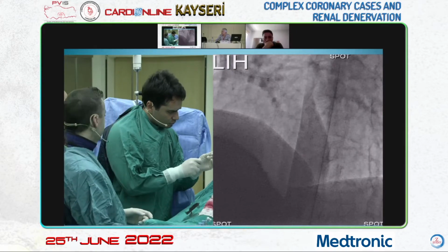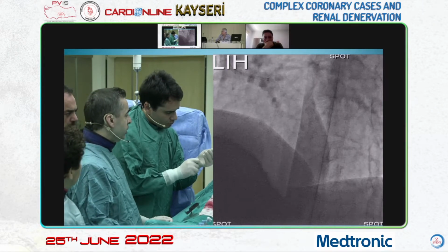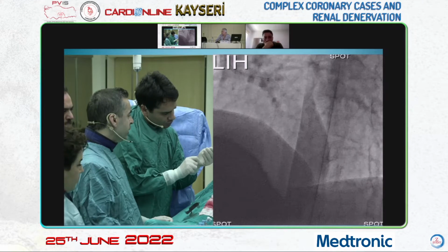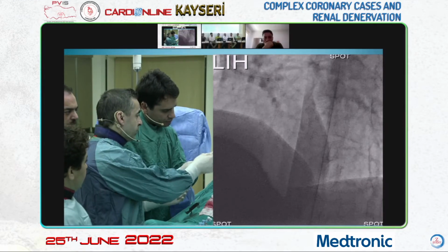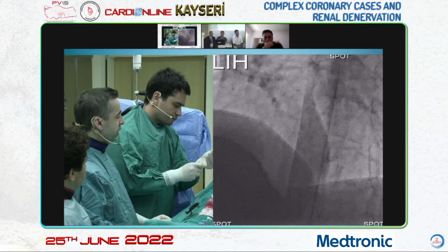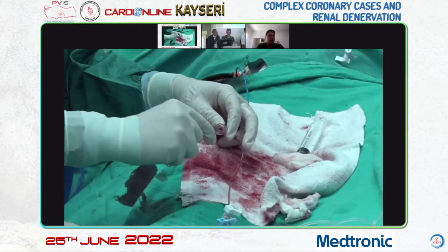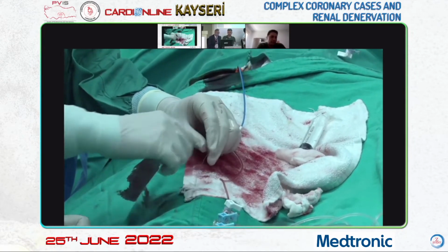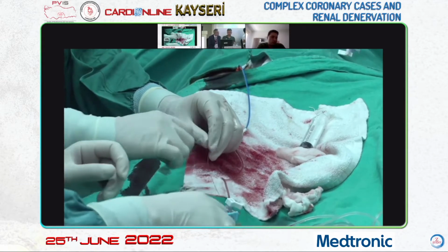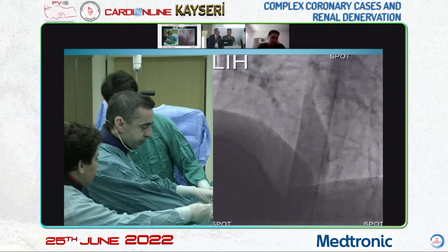In the previous meetings, we already mentioned it: Gaia, or some more rigid wires could be used. Of course, seeing the calcification length of the lesion is important. Seeing the angles is important. Of course, we need to plan it later, depending on the lesion.